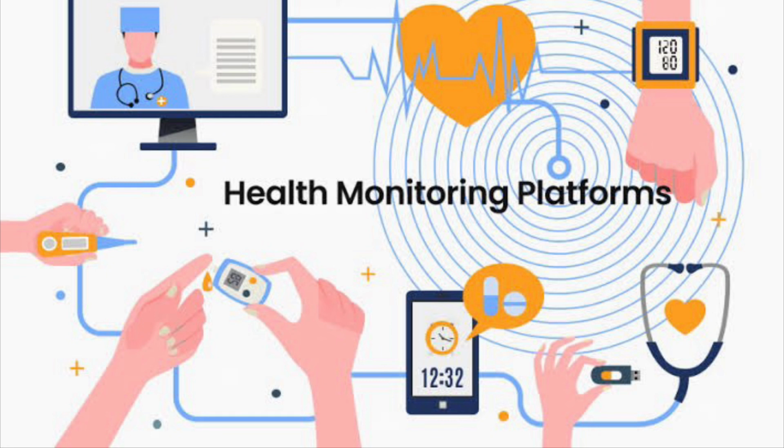The first step is to identify a need that you are addressing with your vital signs monitoring program. For example, it could be that a lot of patients after surgery are coming back for readmission, or untoward events are happening at home after discharge in patients from a critical care unit or from the cardiac department. This could be one need that you need to address.